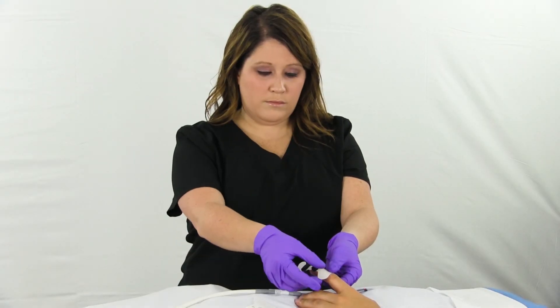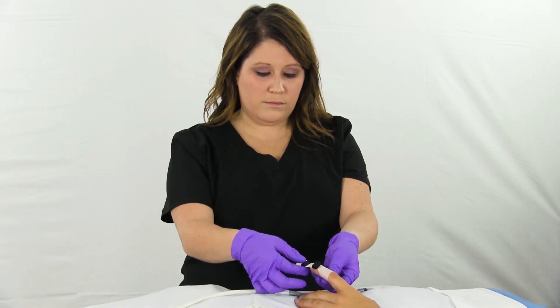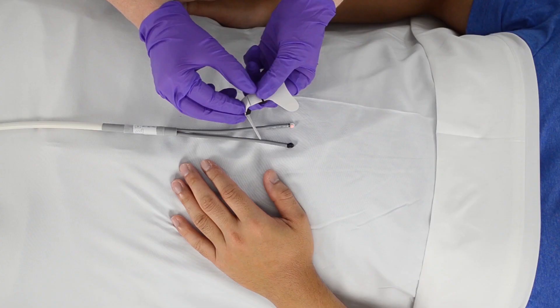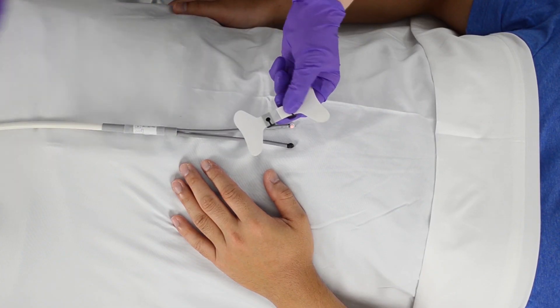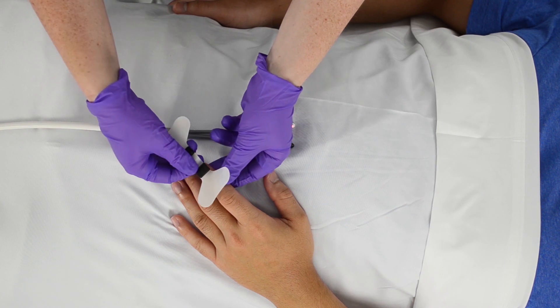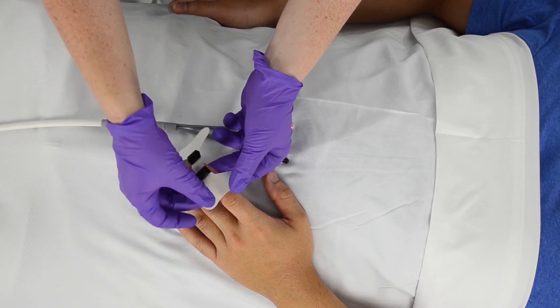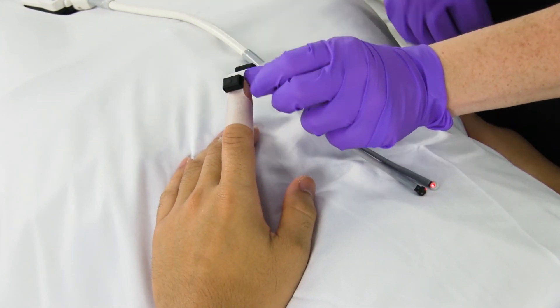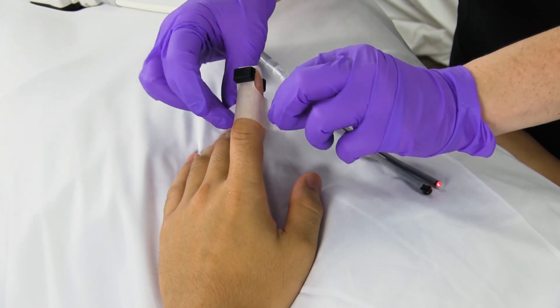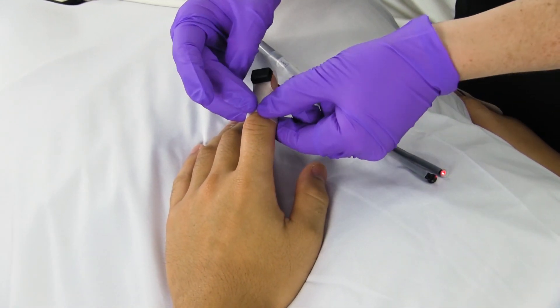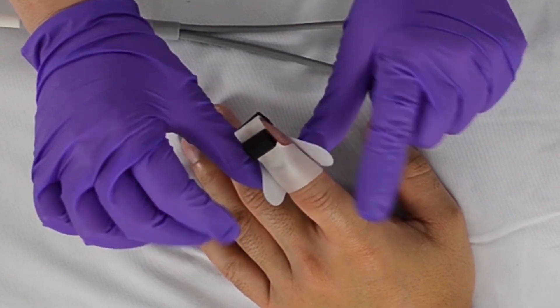The adhesive secure wraps allow the user to test the application site prior to sticking to the patient. To apply the adhesive secure grips, peel off one side and align the sensor over the nail bed and stick it down. Peel off the other side and wrap it gently around the other end, ensuring the black rubber ends are opposite. Gently fold remaining tape around the digit as shown.